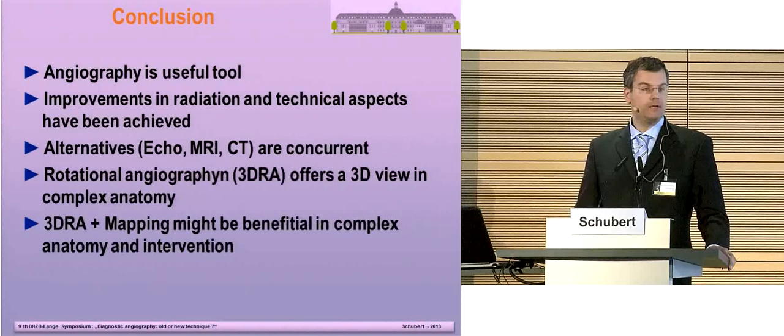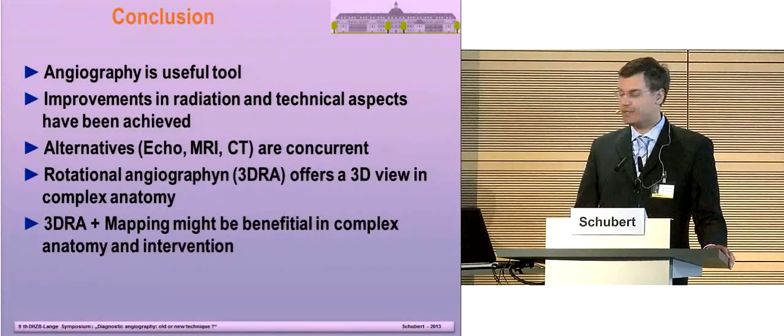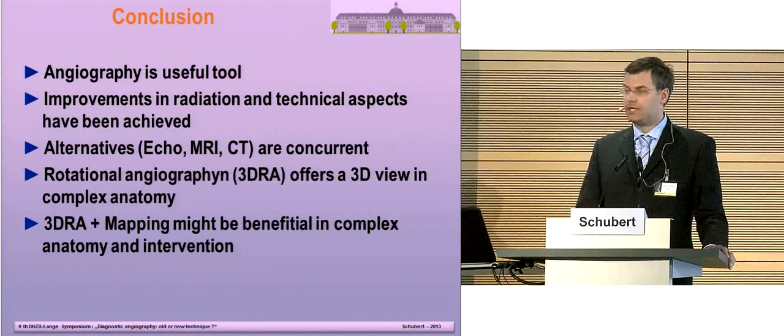We hope that we can get a little more impact from the new rotational angiography and the mapping with the MRI data, maybe reduce radiation, maybe have better planning of interventions, and we hope that we can bring this further on.